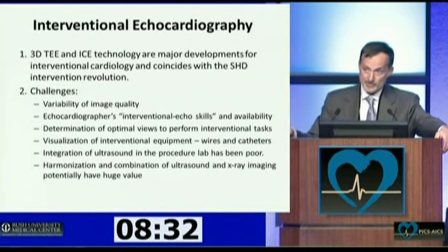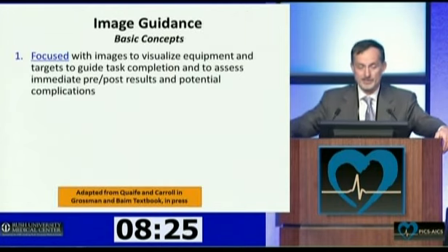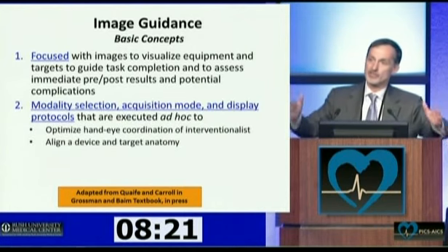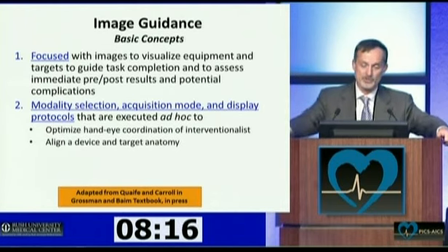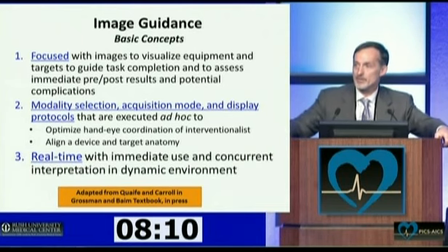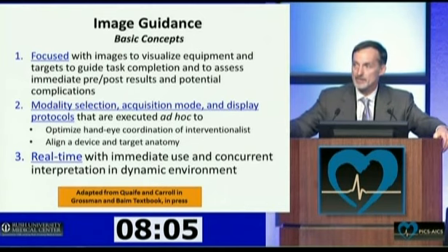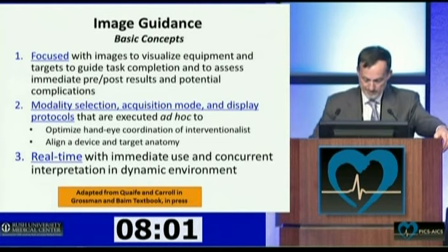And that X-ray still is fundamental. How do we integrate? So imaging guidance is different from diagnostic imaging in that it's very focused. You select the right modality for the task you're going to perform, what sort of acquisition mode, and what kind of display you want. And finally, real time. As Tom pointed out, we are interventionalists, and doing things in real time is key. Structures are constantly changing, and we need that.